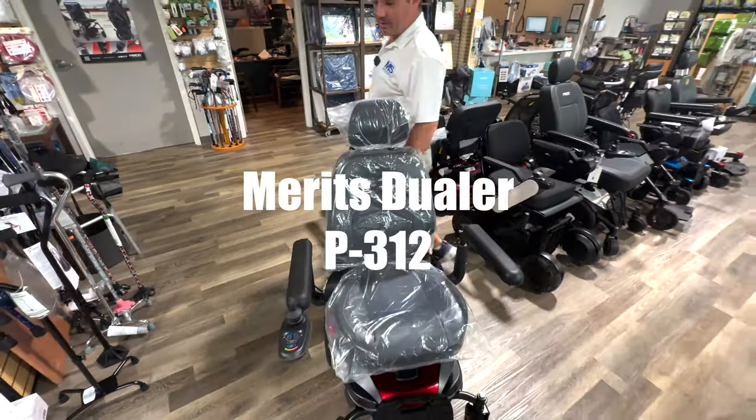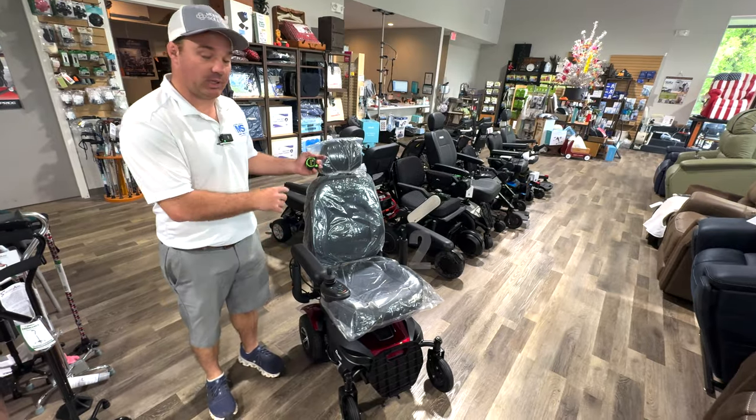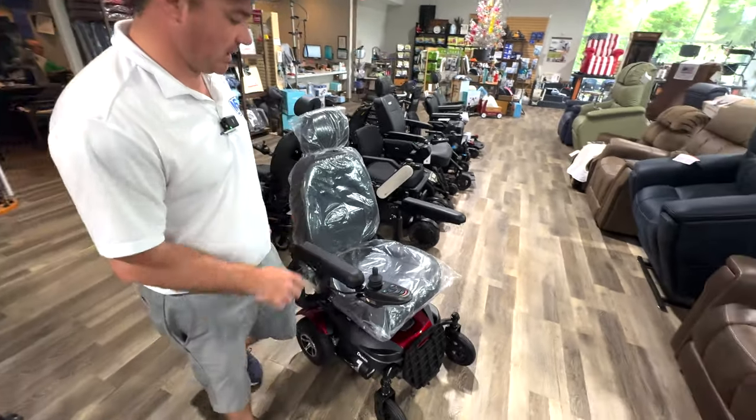This is a power chair by Meritz called the Dueler. The name Dueler means it's a back wheel drive chair but can be changed to a front wheel drive chair, which I'll show you in just a second.